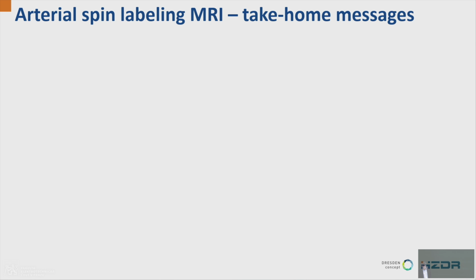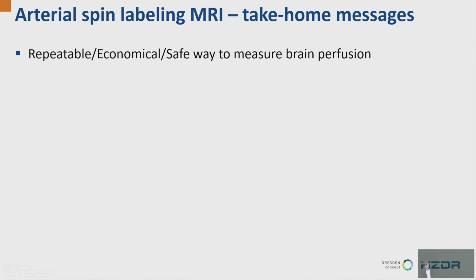So with that, I would like to conclude my talk. So in general, I hope you get the message that arterial spin labeling perfusion measurement is a repeatable, economical, and safe way to measure brain perfusion.